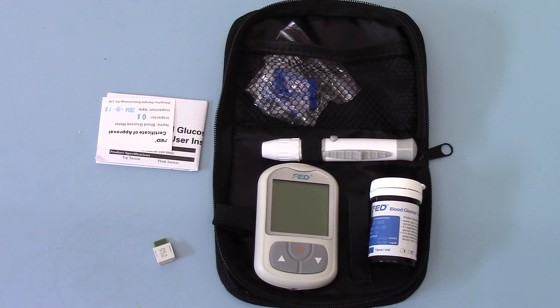In part two we'll come back and show you the setup of the meter — the insertion of the battery and setting the time and date on the meter — so that you're ready to start testing with memory recall of the test results.